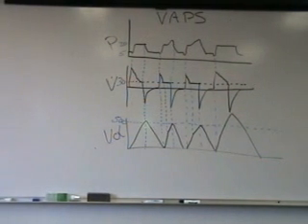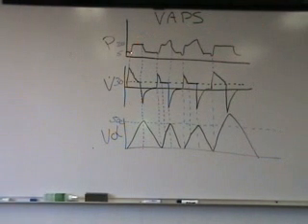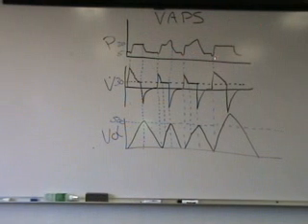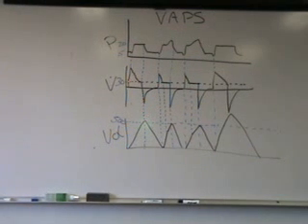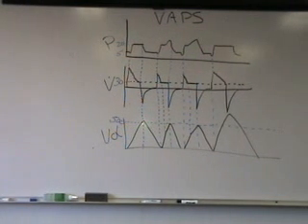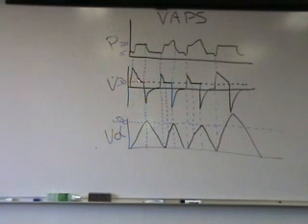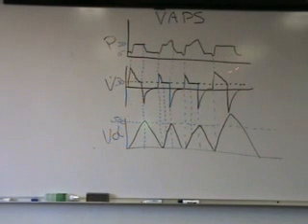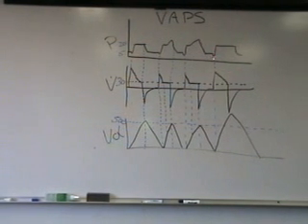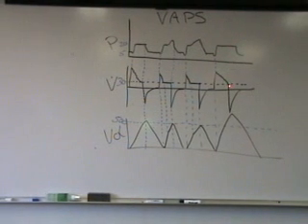So to classify volume assured pressure support, you would say it's only patient triggered into inspiration. On a breath that the volume target was delivered before the flow rate, or when the volume target was delivered as the flow rate decelerated to your set flow, the pressure supported breath would be a normal pressure supported breath, meaning it's patient triggered, pressure limited, and then flow cycled.